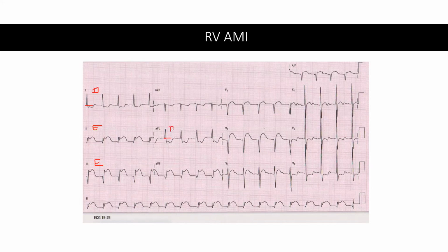Depressed. Okay. How about AVF? Depressed. Okay. So let's stop right there. And oh no, this is elevated, right? This is elevated. Okay, let's stop right there.